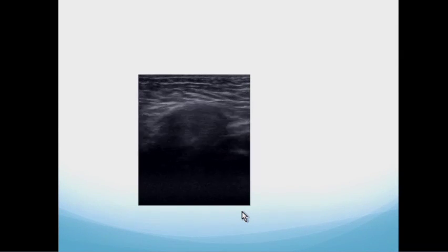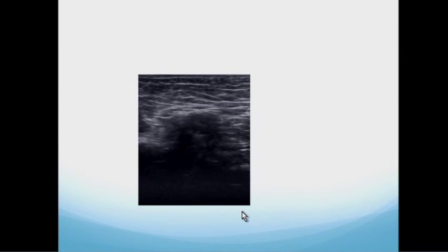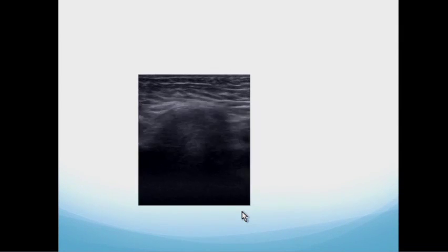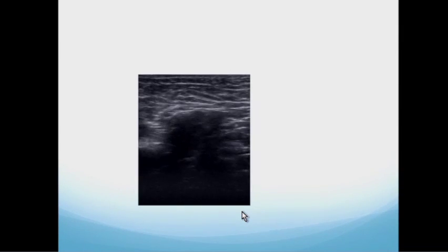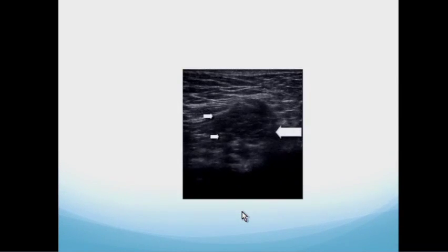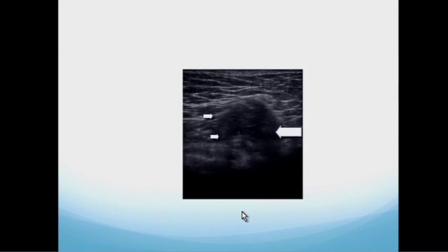This is another direct hernia, posterior to anterior, towards the transducer. This hernia does not reduce completely, so this is at risk for strangulation. And a third direct hernia, protruding towards the transducer. Occasionally these can take a course that's obliquely through the muscles and can be very confusing.